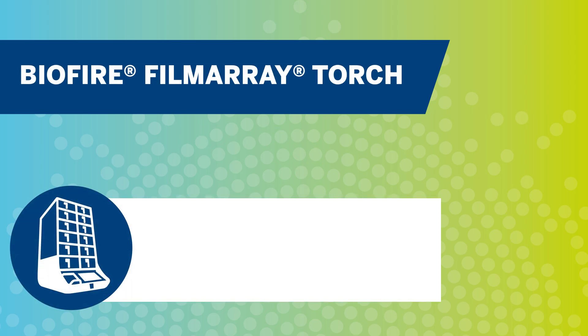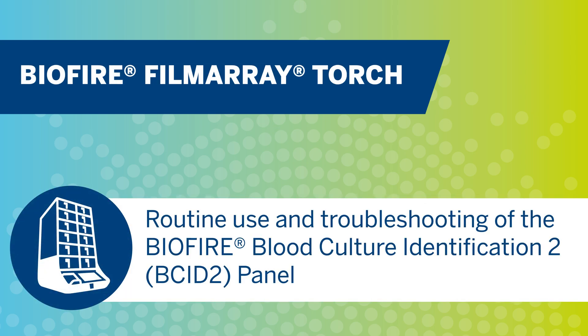Hello and welcome to the training video for the routine use and troubleshooting of the BioFire Blood Culture Identification II panel. This video will discuss setup, loading, and troubleshooting of BCID II panel results, as well as discuss additional testing that is recommended to be run in conjunction with the BCID II panel.